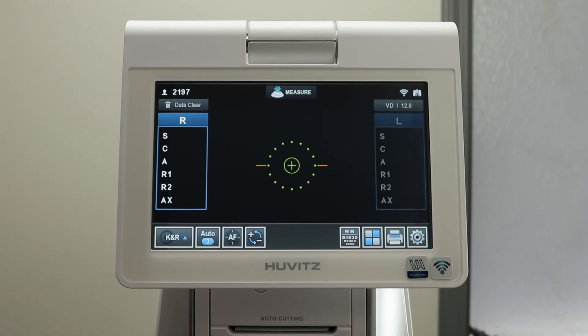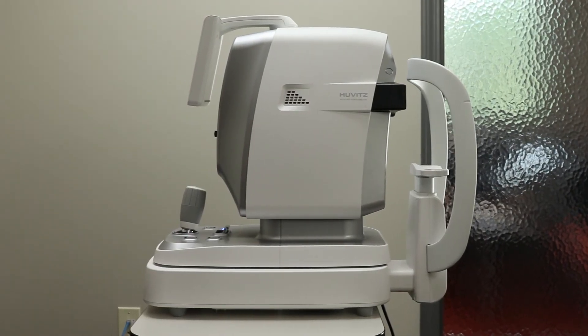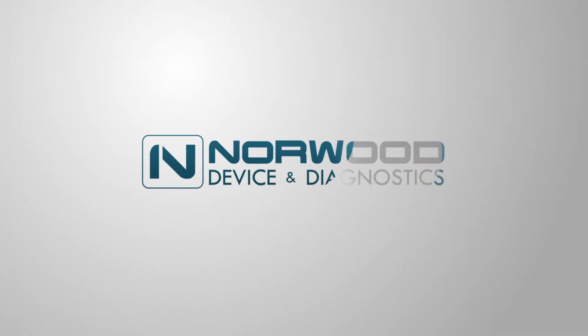When you are finished an exam, press the Data Clear button in the left-hand corner. Now you are ready to begin your next exam. The Huvitz HRK-9000 Auto Refractor Keratometer — one of the many great products from Norwood Device and Diagnostics.